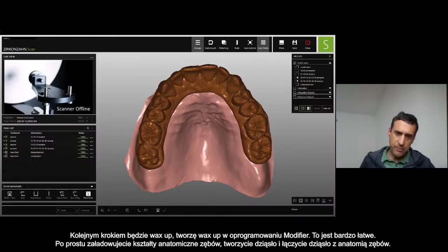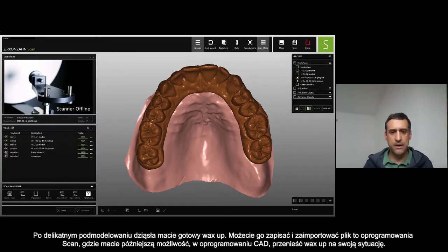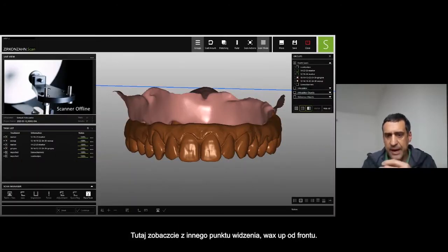The next one will be the wax-up. I can create a wax-up also with the modifier software — really easy. Just load anatomies, create the gingiva, connect the gingiva and teeth together, do a little bit of design on the gingiva, and you have your wax-up. You can import it into the scan software and then adapt your wax-up to the situation you have.